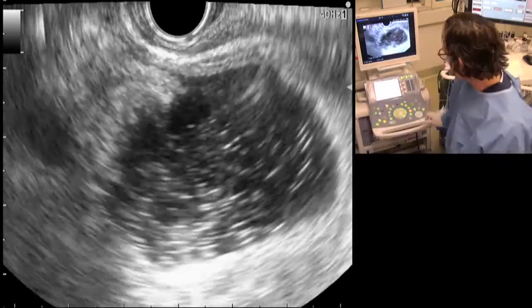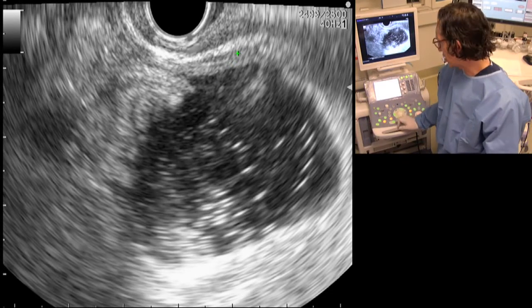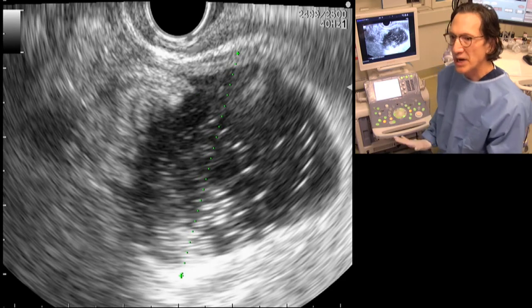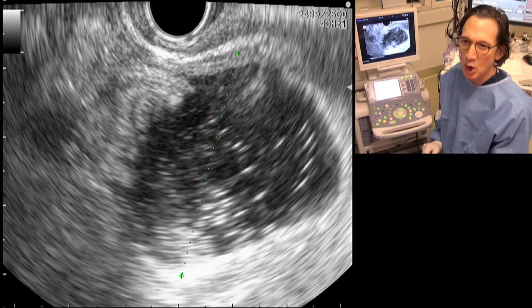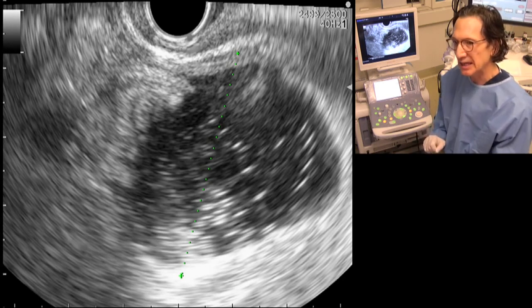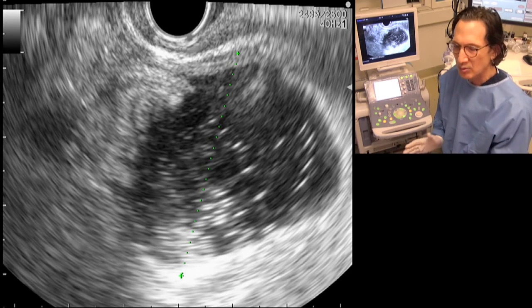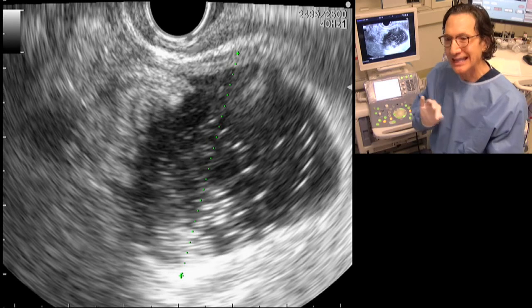So let's measure out the size of this. The challenge now for gallbladder drainage is how do we do this drainage avoiding any risk of bile leak? We want to be able to get into the gallbladder, place our lumen opposing stent, and get out as quickly as possible, and ideally eliminate any risk of bile leak.